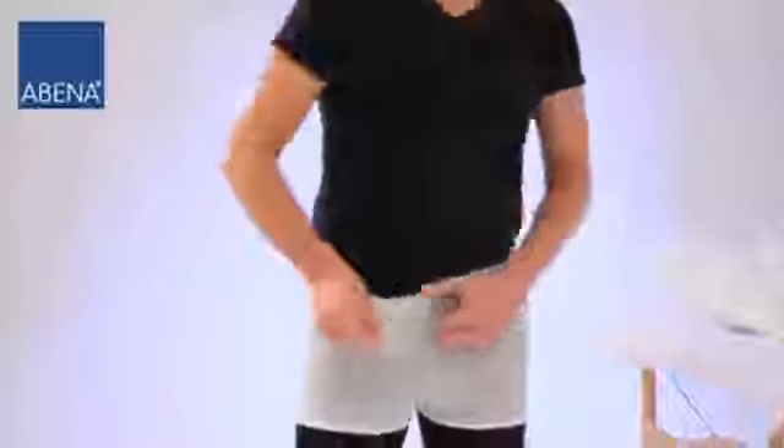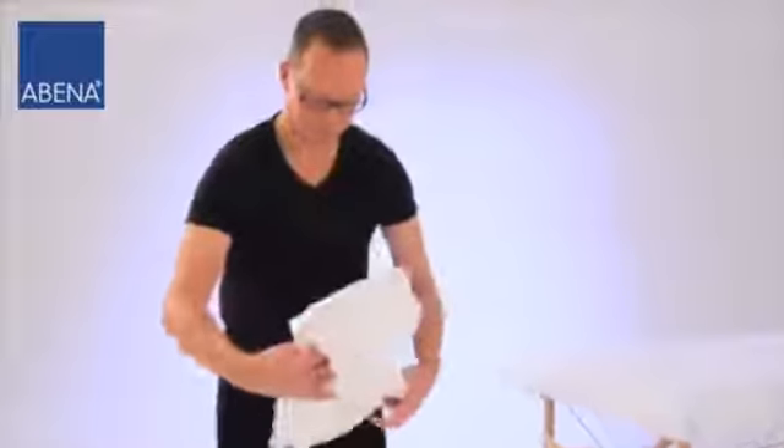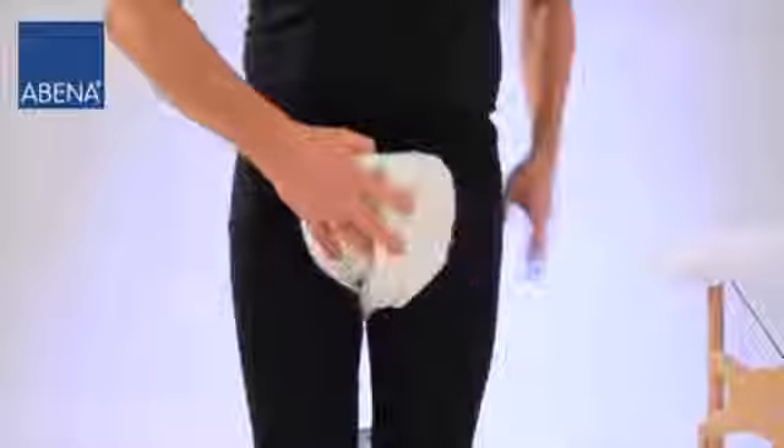Pull the fixation pant halfway down the legs. Then take the pad and pass it, beginning with the wide side, through the legs from the front to the back. The wide side should be facing backwards during this procedure.